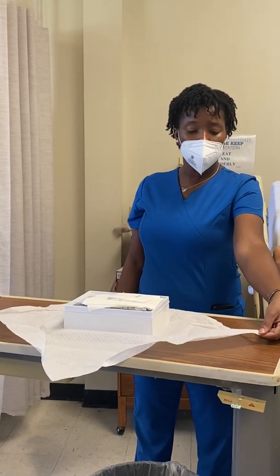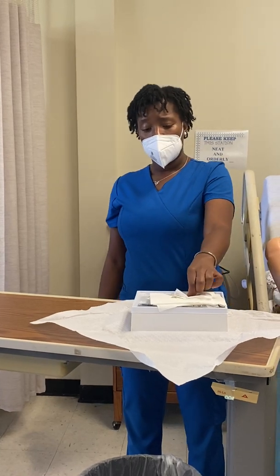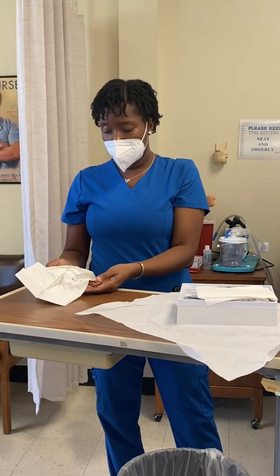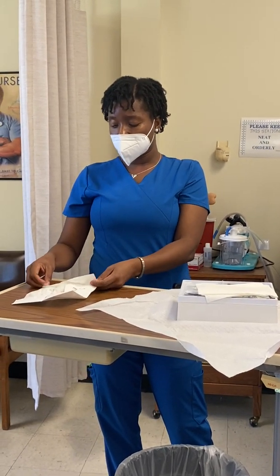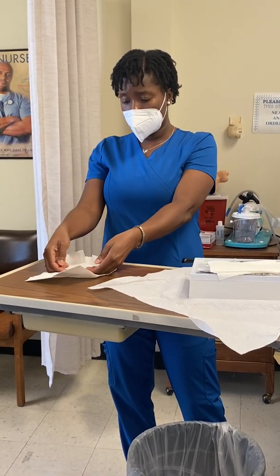Okay? All right, so I'm going to pull this over just a little bit because I want some room to put my gloves on. You'll understand what I mean about these little gloves. You see how tiny they are? You're probably not going to be able to wear these gloves. I'm just going to be honest with you because they're so small. So, here I go again, putting my sterile gloves on.